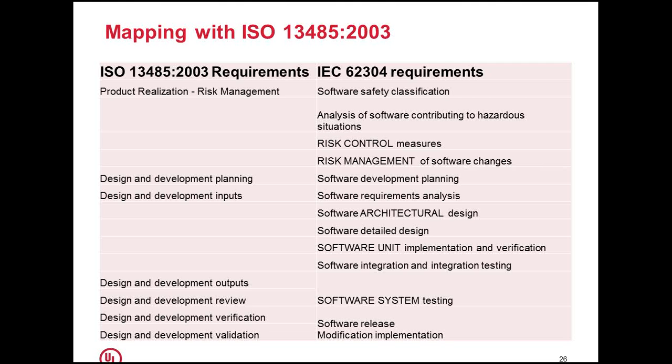Then let us go into the design process. The design process in the standard quality management system clearly specifies a PDCA, that is plan, do, check and act methodology. So you need to do the plan first, determine the inputs, do the design, identify your deliverables, and develop the product.